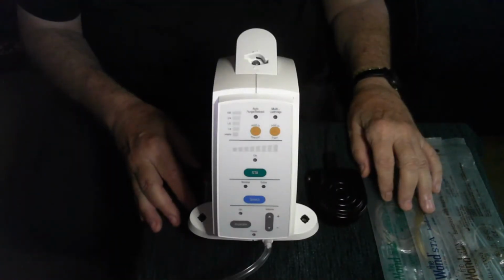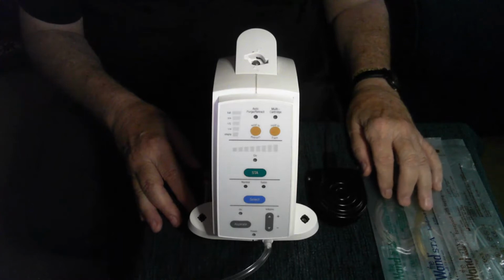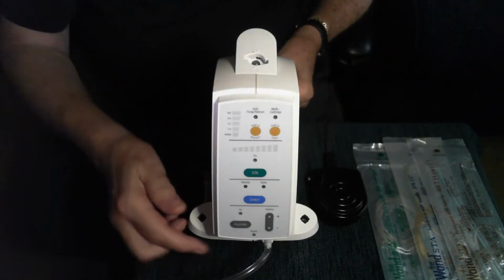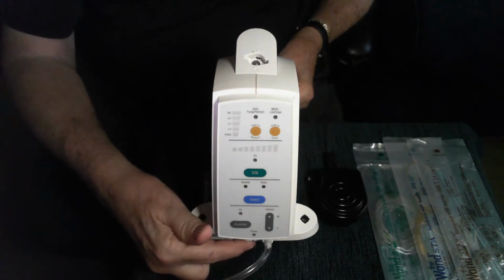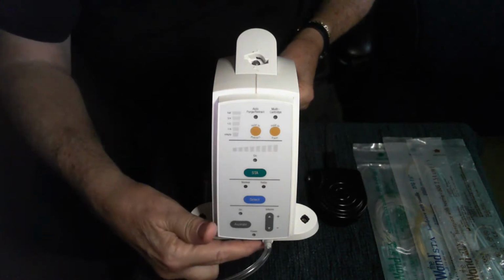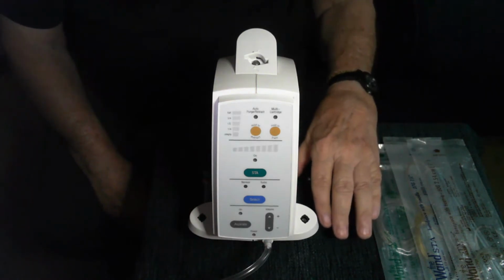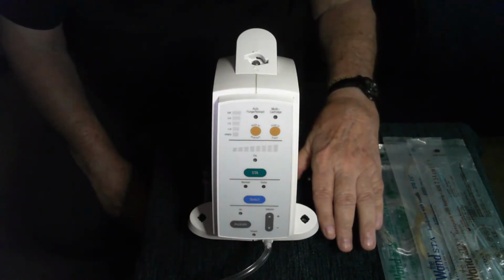As you can see, the Wand STA is a very simple instrument. There's just a power plug in the back. Then there's a foot pedal that screws into the front. Make sure this is on very tight. The foot pedal is going to start the flow of the anesthetic, and it has other functions which I'm going to tell you about.